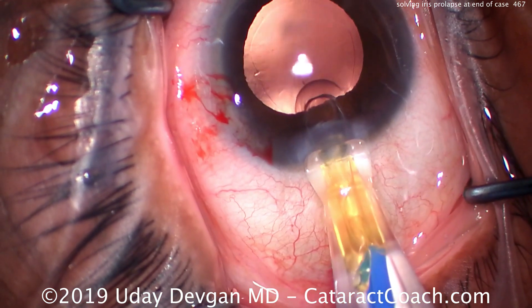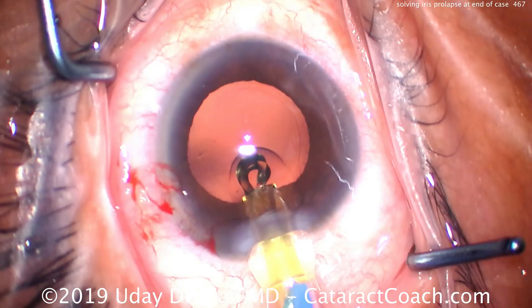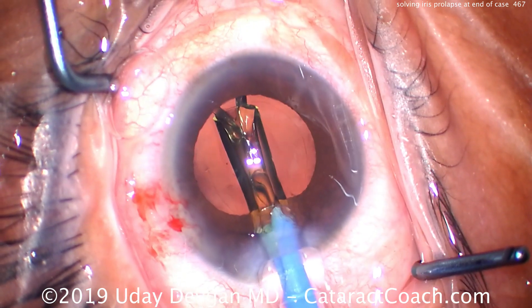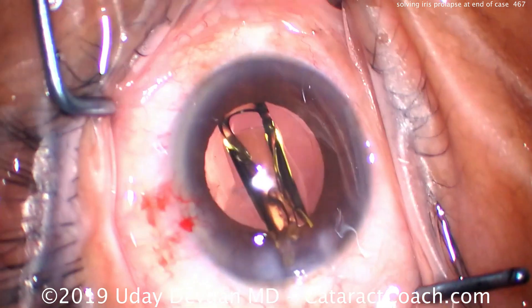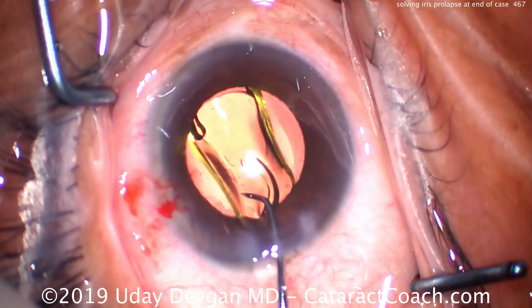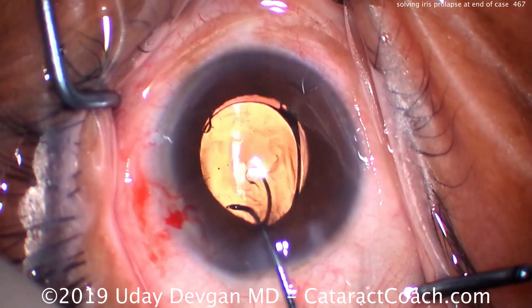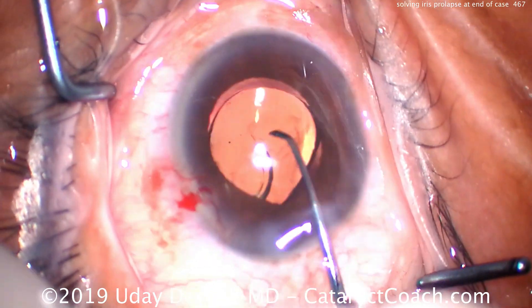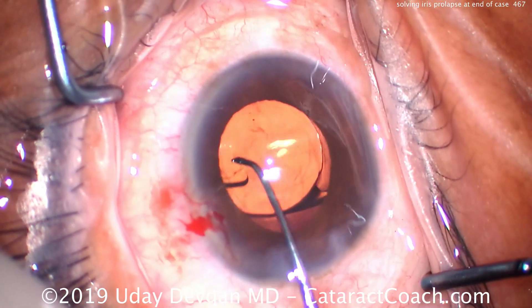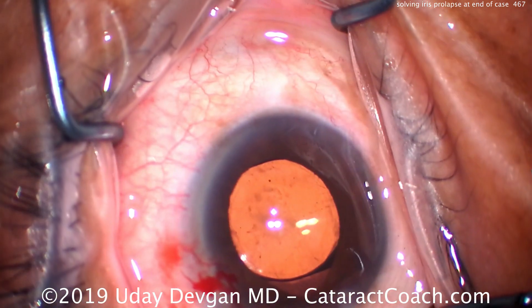We'll inject the lens. When you put the lens in the eye you can also add more viscoelastic. You can see the leading wave of viscoelastic as the lens goes inside the eye and into the capsular bag — this increases the pressure inside the eye behind the iris. If you have high pressure behind the iris and low pressure in front of it, that pressure gradient is going to cause a prolapse. And there it is — iris prolapse, a little more through the incision. Not terrible, but you can see it.